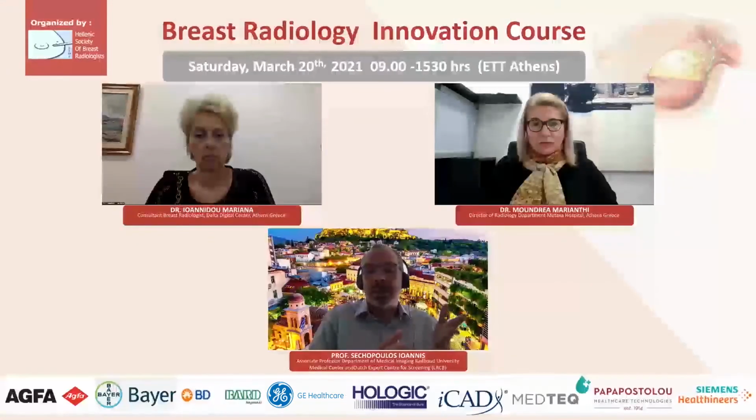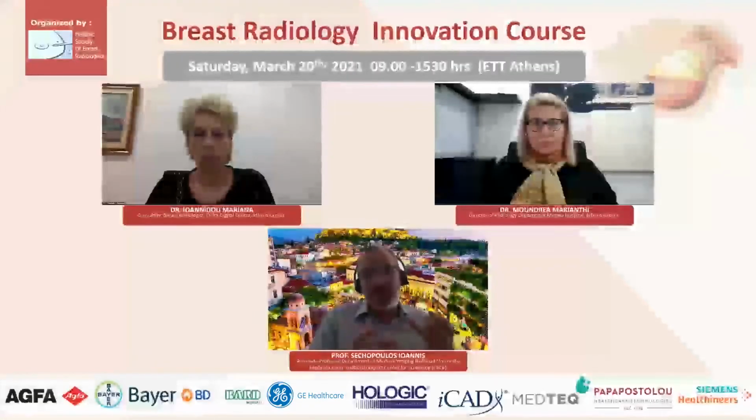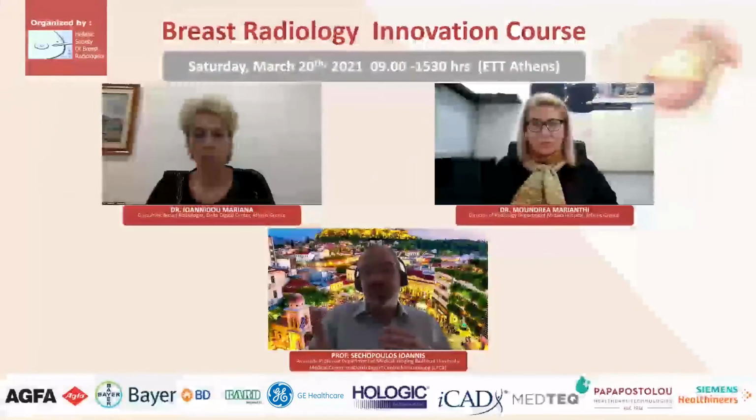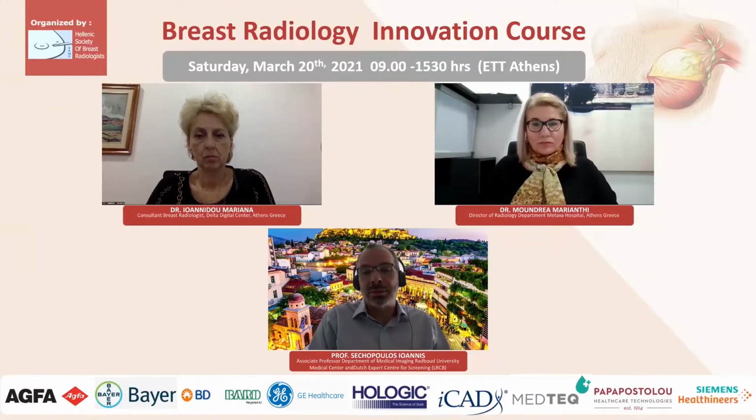The other ones that are based on, we should do only MLO acquisition and MLO reading, and single reading, I think there's more evidence for that. So those also don't open any ethical question about AI reading. So those I also believe that we have plenty of evidence for.